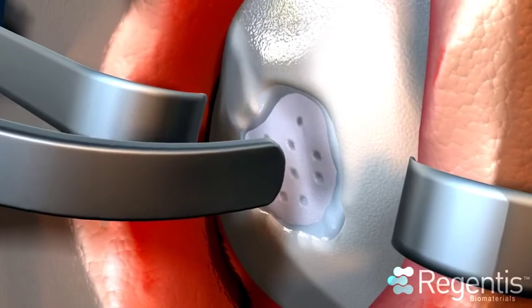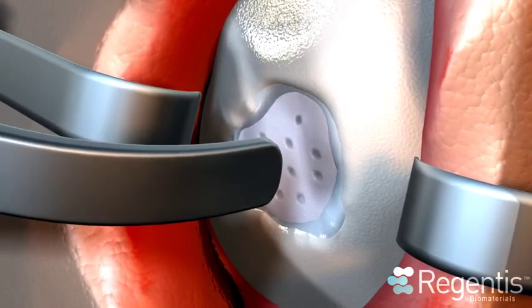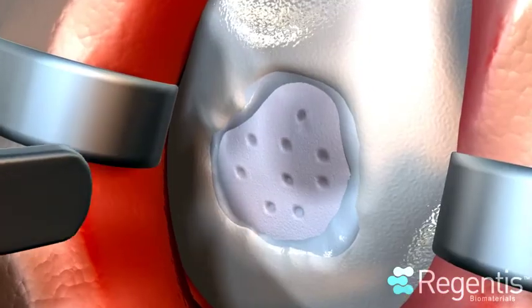The Gelrin-C implant conforms to fit tightly with the surrounding tissue and underlying bone with no gaps.